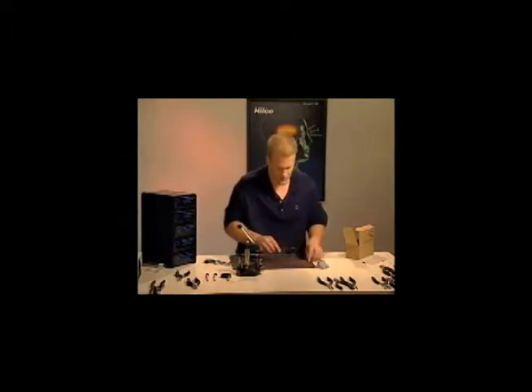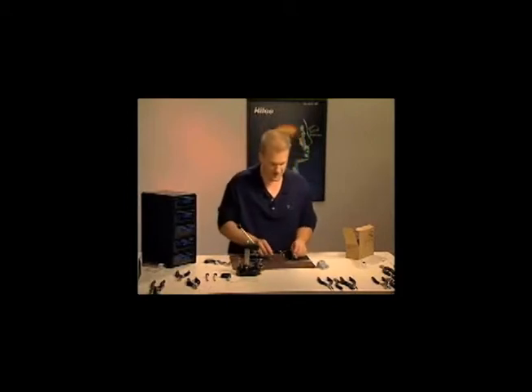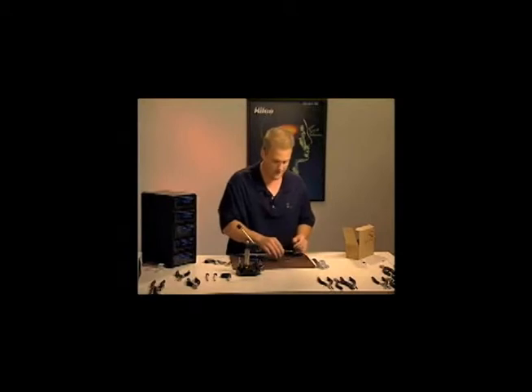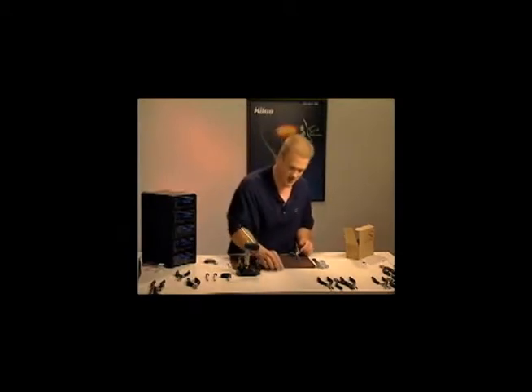Now, by using this method, one of two things is going to happen. Either the screw is going to strip, or the hardware in the frame is going to strip. And I find the best way is just to go right to a repair screw and forget about trying to finagle a replacement screw in there. I want to use a self-tapping repair screw so I can tap new threads into the frame. So I will do that by taking the screw that I just punched out.